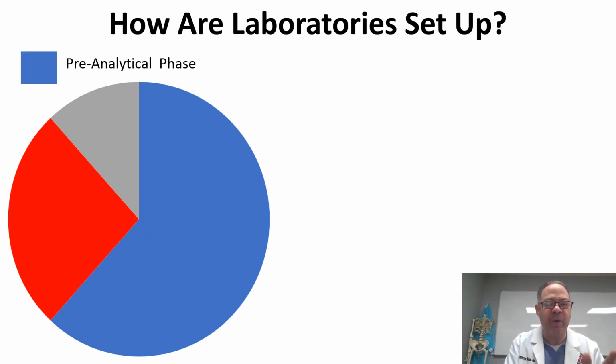So the first area that the lab is set up with is called the pre-examination phase or the pre-analytical phase.